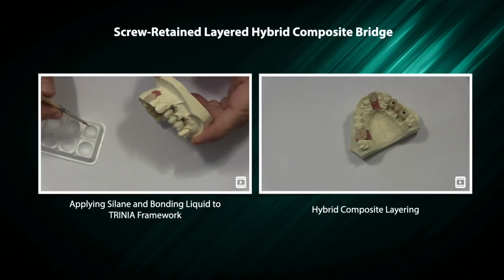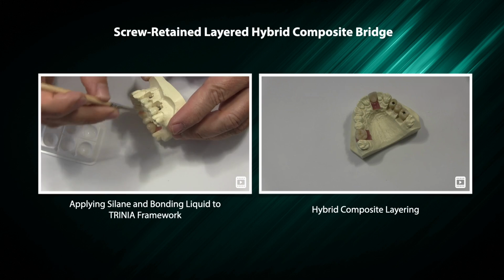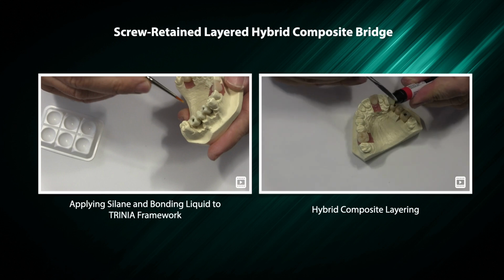Applying silane and bonding liquid to TRINIA framework. Hybrid composite layering.